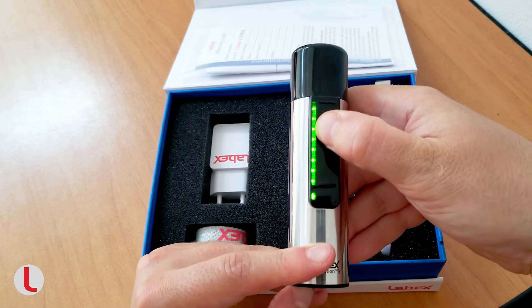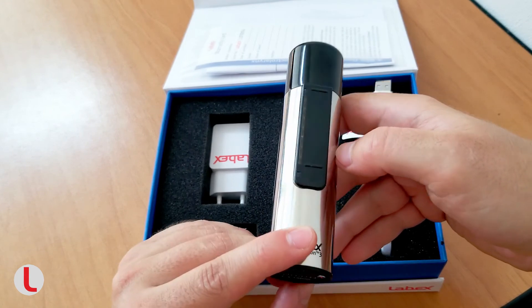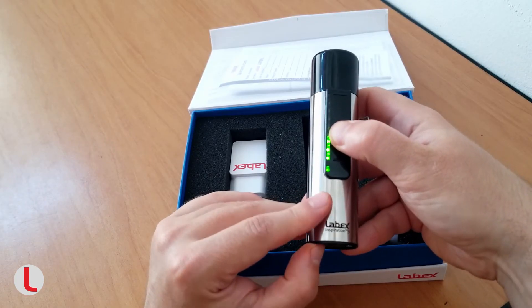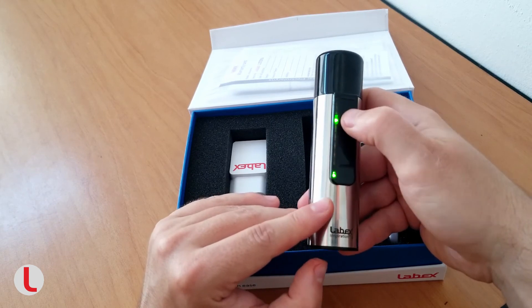Regardless of which mode you are in, you can modify the volume to your needs. Simply touch the slider, then hold the settings button, and slide your finger up and down the slider to change the volume. Take off your finger or release the settings button to confirm.